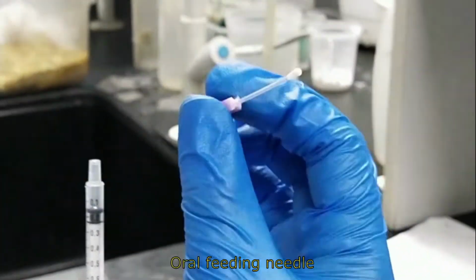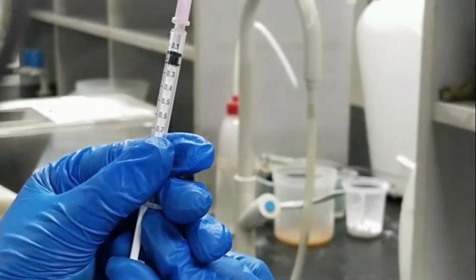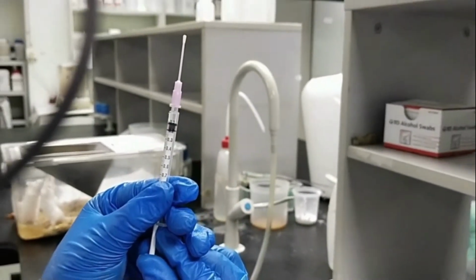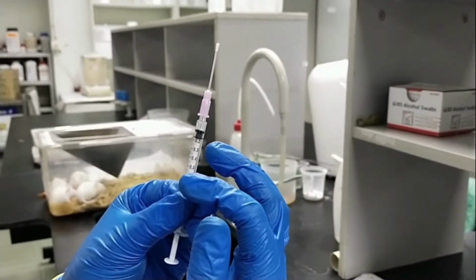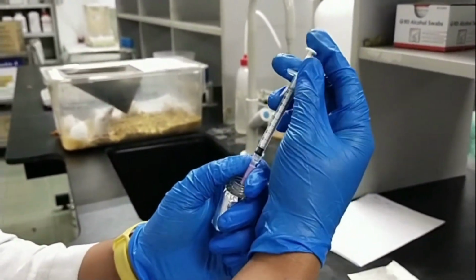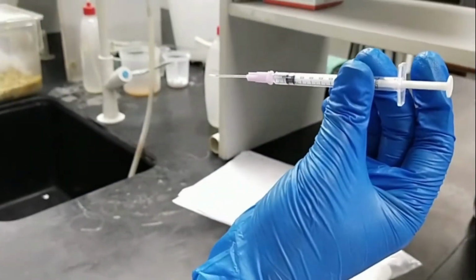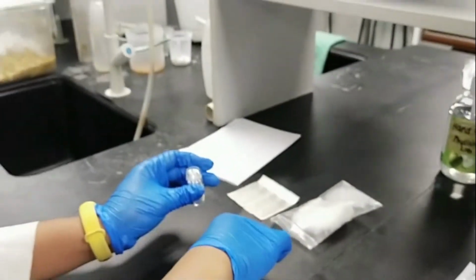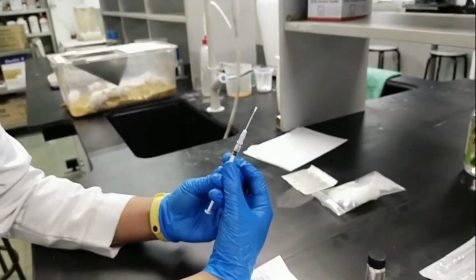Then we need to transfer. This is what we call the oral feeding needle. We're going to use it for the oral feeding. So we're going to need to push the drugs all the way up. Okay, and from here we need to adjust the volume to 0.13. Alright, so now it's already 0.13 ml. And now we're going to proceed with the injection.